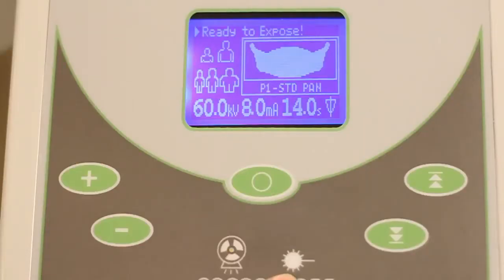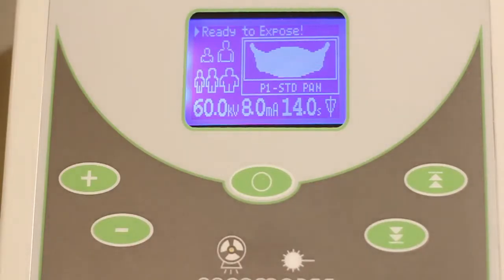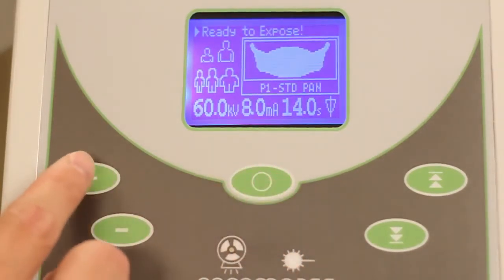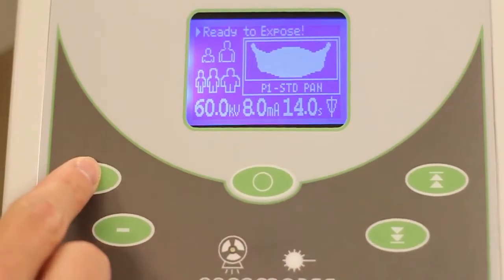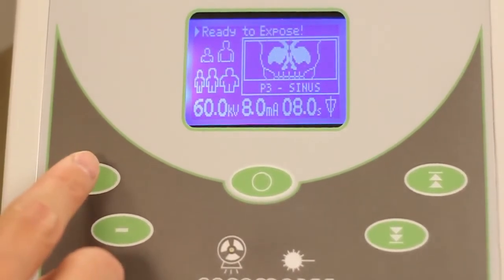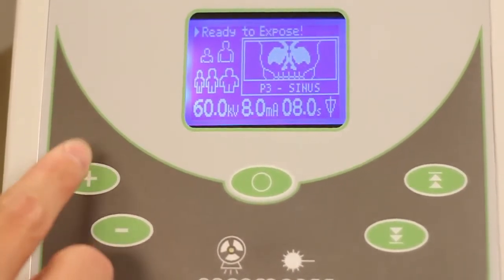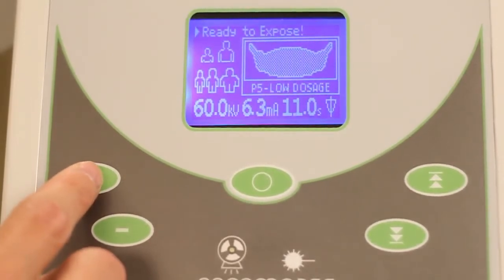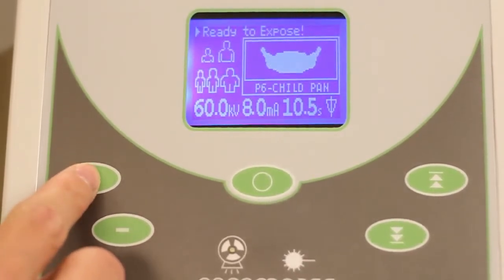Now that the various buttons have been described, the process of selecting the optimal patient settings can be started by pressing the select button in the center of the control panel until the highlighted box is located in the image profile area. The options include standard pan, TMJ, sinus, improved orthogonal, low dose, pediatric, and bite wing.